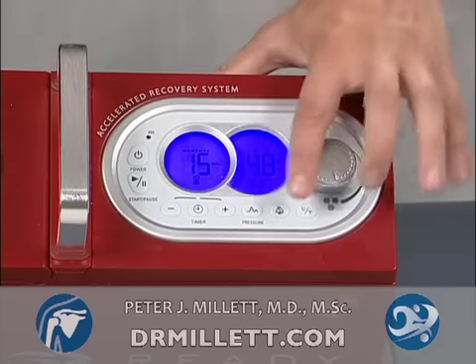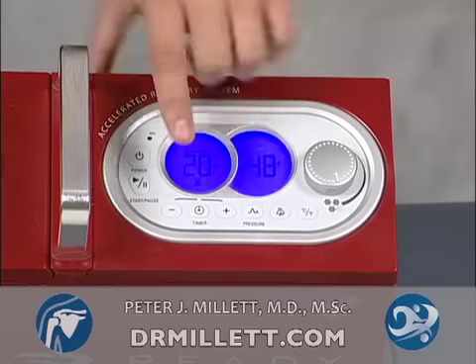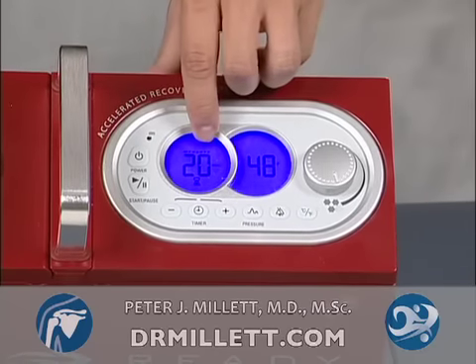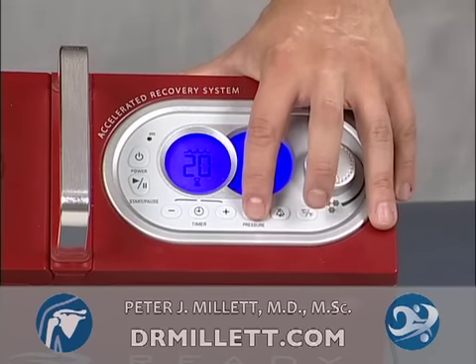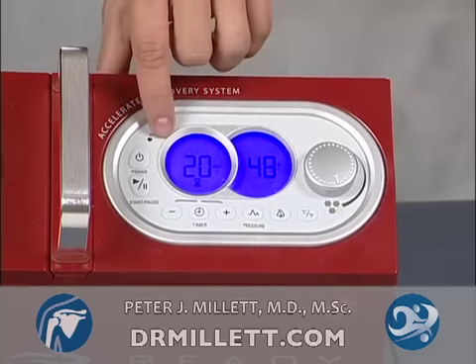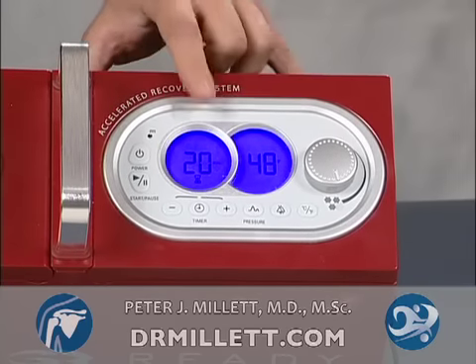If you're on this screen, you can use the plus button to increase the amount of time the unit is on. By hitting the pressure button, you can increase the pressure. A single line means that there's mild pressure. Small mountains mean moderate pressure, large mountains, maximal pressure. One more time deletes or excludes all pressure that is applied to the cuff.